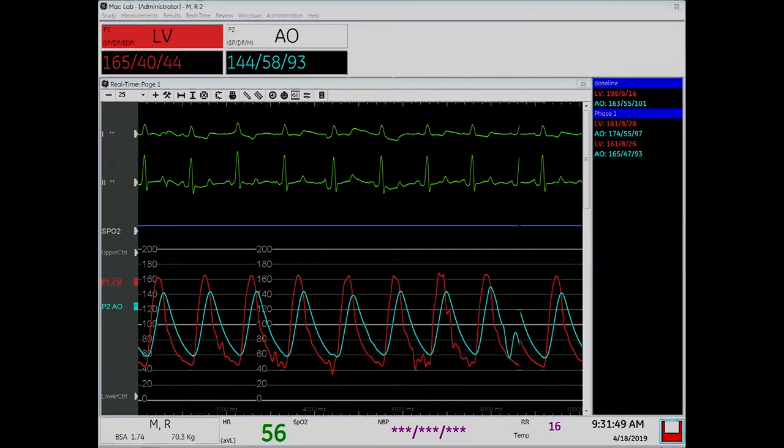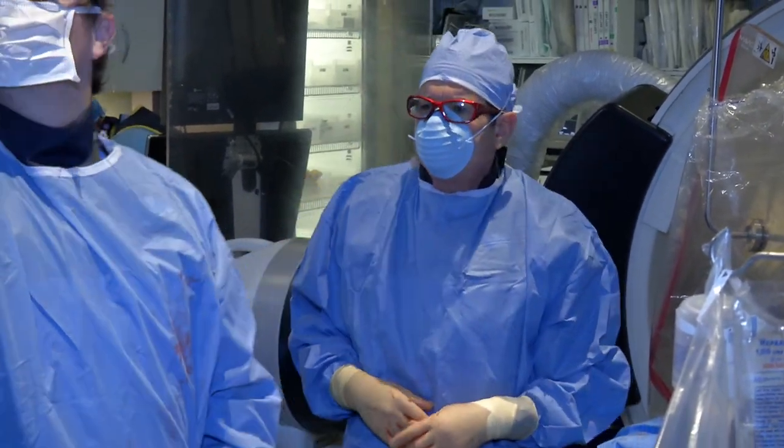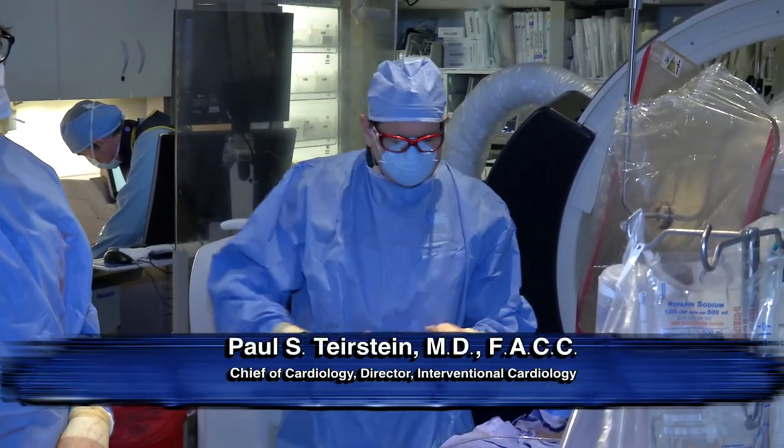Any questions? Ray's going to start closing. The closure takes 10, 15 minutes, and it's kind of boring, because he just has to cinch up those sutures, and you can start doing your thing.